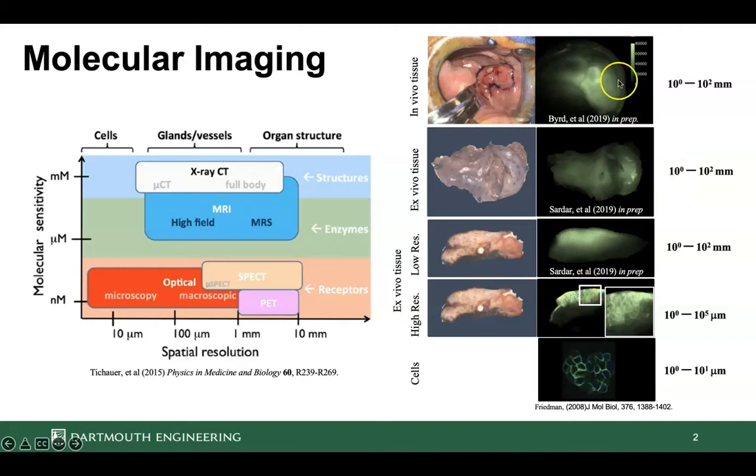As you can see, we're able to observe the fluorescence in the in vivo situation at low spatial resolution, and we can increase that spatial resolution as the tissue travels through the pathology. In fact, we can even start to see cellular patterning down at the submicron range, and we could also take a microscope and look at the cells at the actual expression level on the cells themselves.